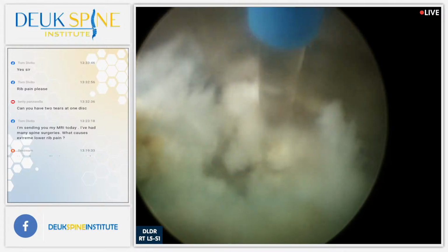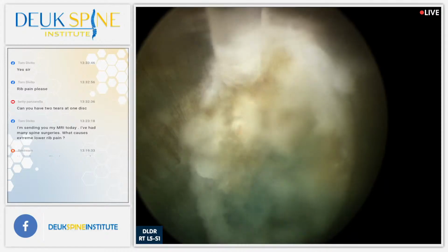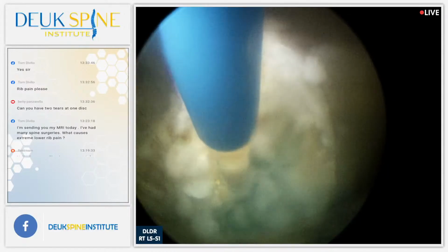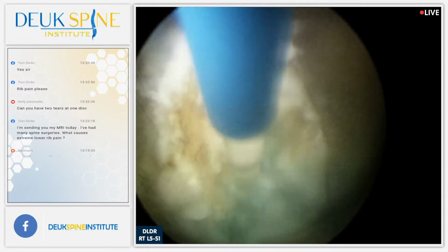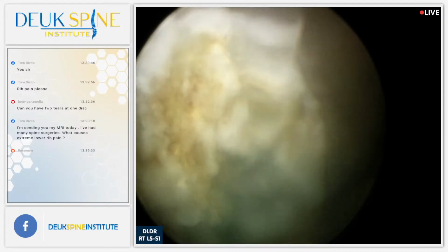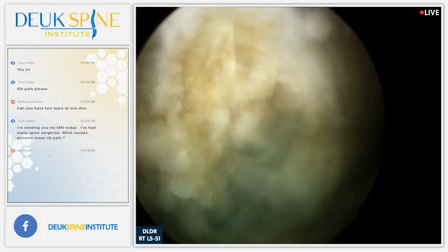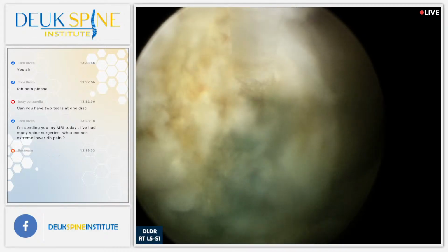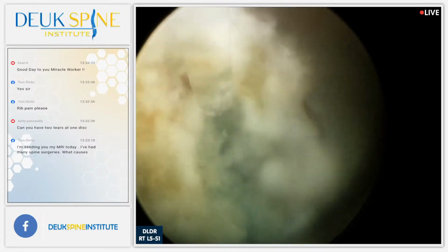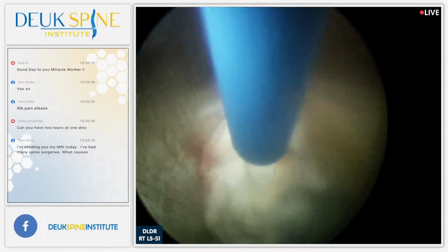For those of you who have never seen this surgery, that is a laser fiber. The laser itself is a machine the size of a big suitcase. It's located at the foot of the bed. In our new website, you'll be able to see what it looks like. It's a Holmium YAG laser. And we have 10 of them, in anticipation of growth. So, anyway, we've spent the last year collecting lasers.